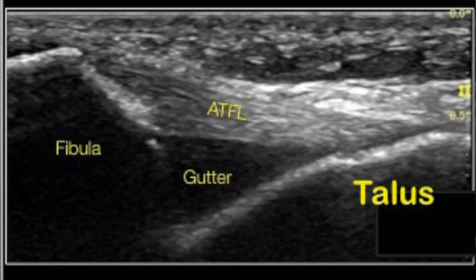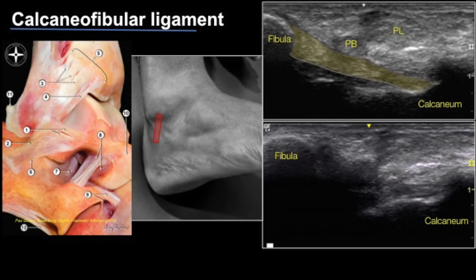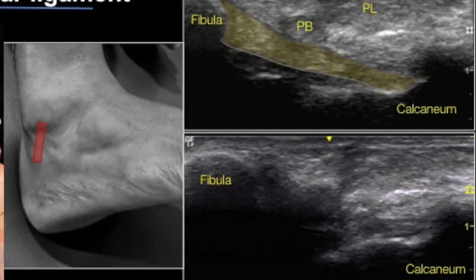The calcaneofibular ligament is located between the calcaneum and the fibula. The fibular attachment may be slightly difficult to assess; however, with forced dorsiflexion the entire calcaneofibular ligament becomes taut and can be visualized very well. Dorsiflexion also improves visualization of the peroneal tendons. This ligament requires a little dynamic maneuvering and can be easily assessed on the long axis.